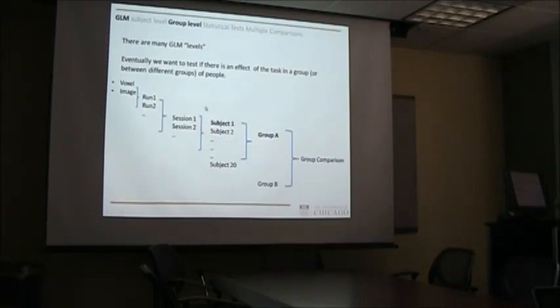If you wanted to do it at different ages, what other variables would you need to control for? Because you talked about the different things, that noise and different things. Yeah. If you would want to correct for age, then you would do that usually at the group level. So you would include the factor age as a covariate.